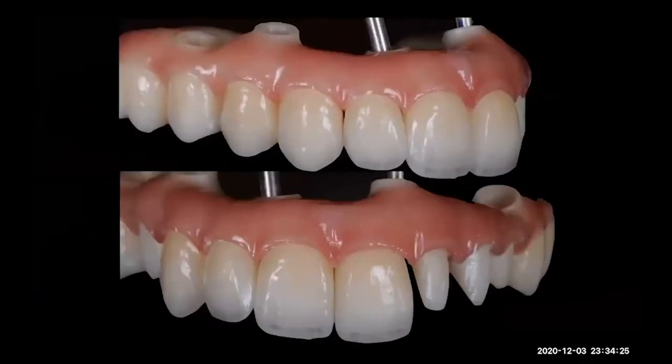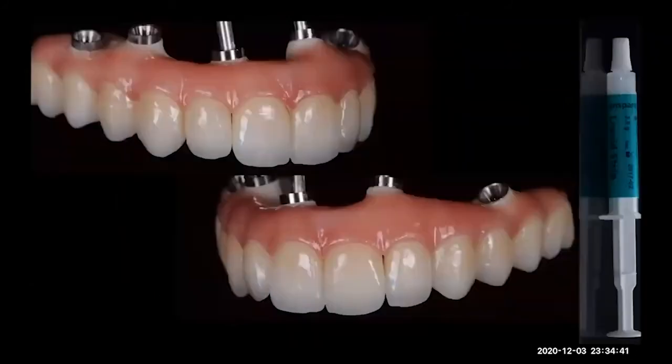When we are happy with the colors, and of course, we already have some internal characteristics in the scoop area. And you can see the translucency we can create with the calibration of the wax. Now we are focusing more on that. And now we already filled all the spaces with different ceramic. At that time, we glue the crowns directly to the zirconia. And we use that glycerin liquid around the margins to avoid some discoloration of the cement later on.